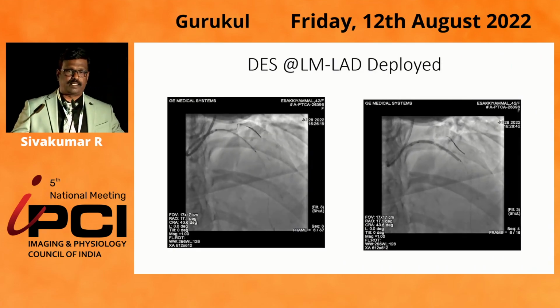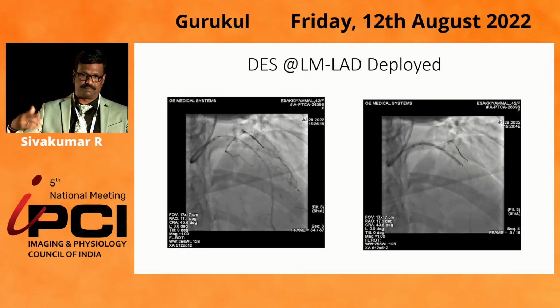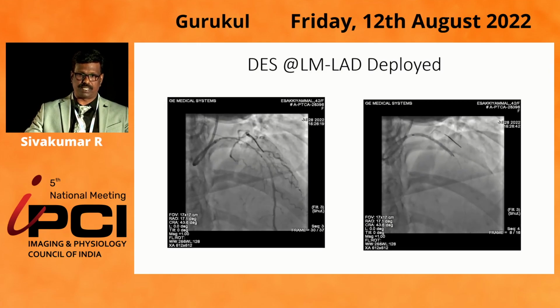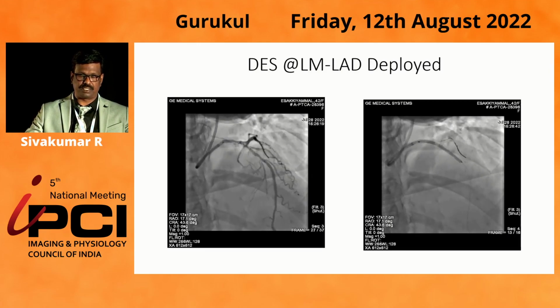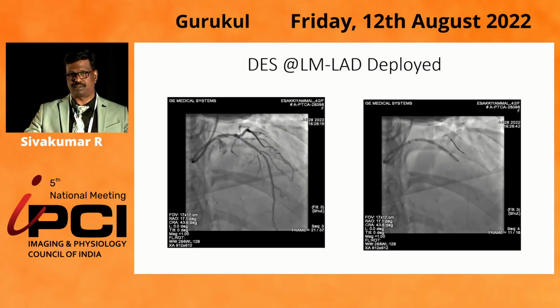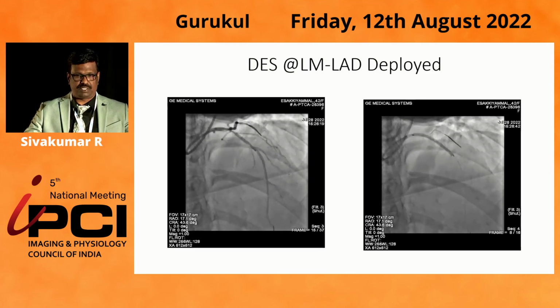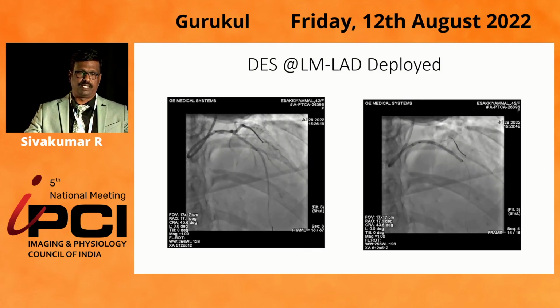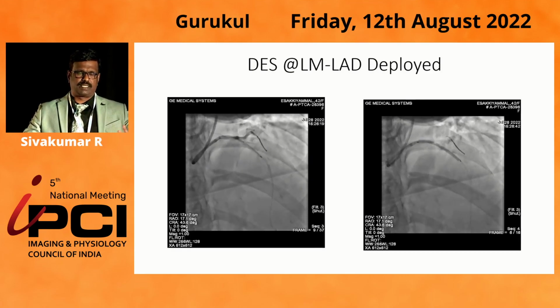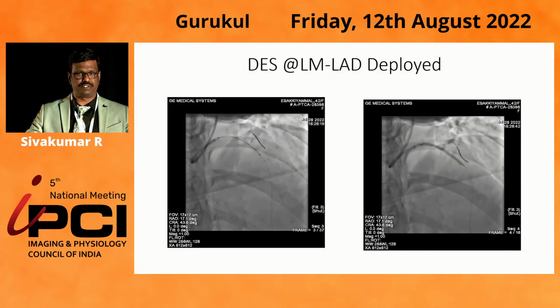Yeah, I think with the currently available 3D OCT, whether it is simple cases or complex scenarios or left main bifurcation, apart from routine optimization based on the MLD max algorithm, this is really going to give a lot of confidence in finishing a case, rather than with angiography alone. It's mathematical, it just guides you like an arithmetic so that you can confidently finish your case.